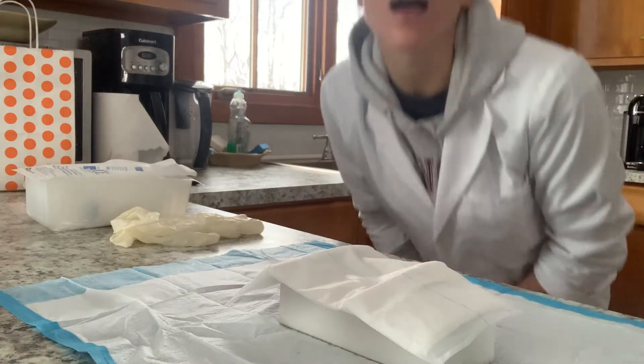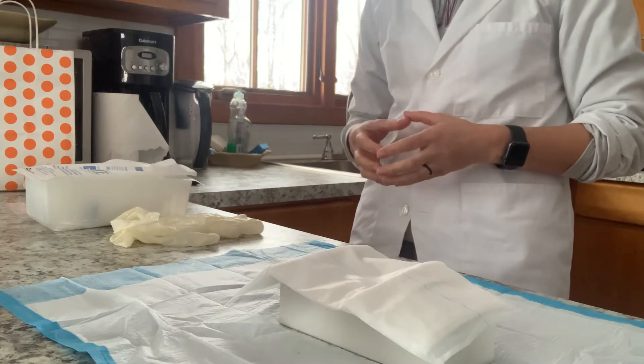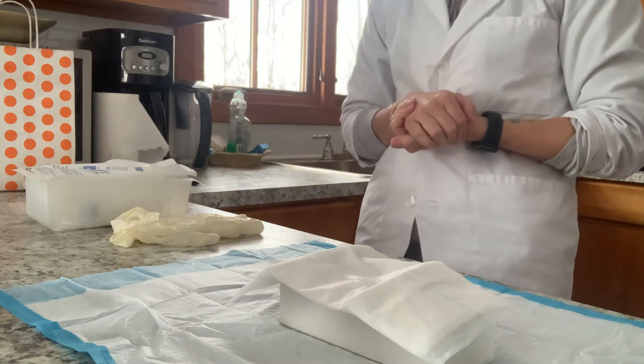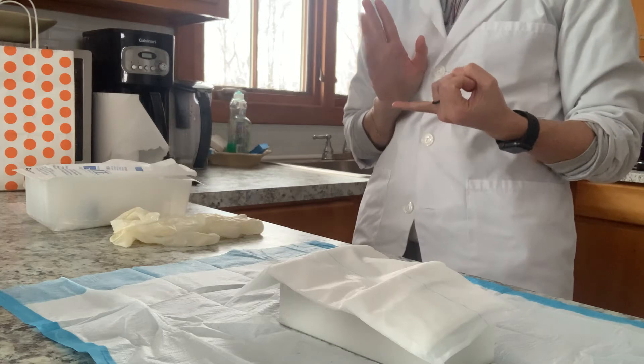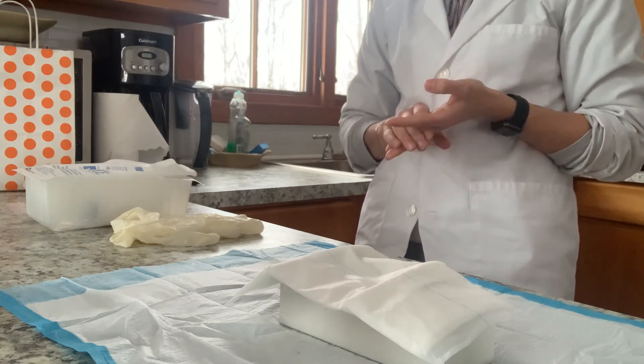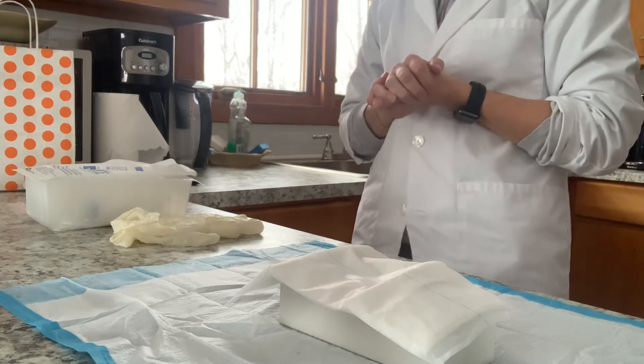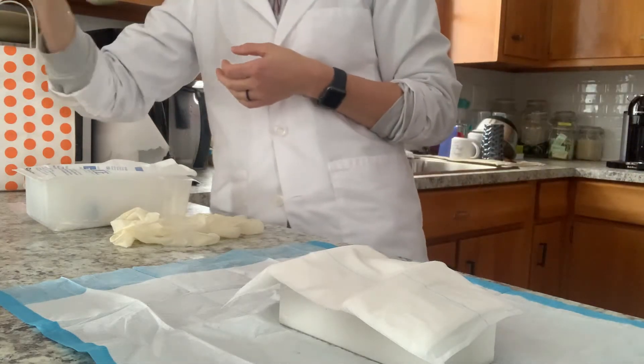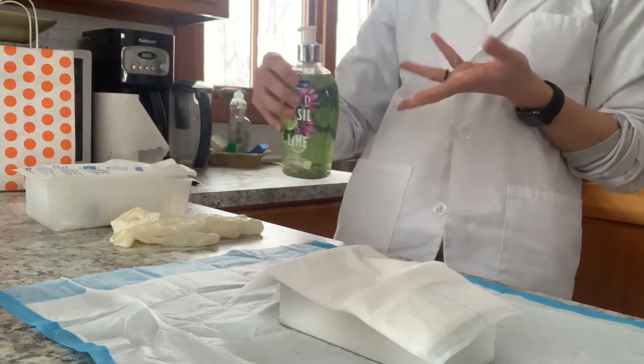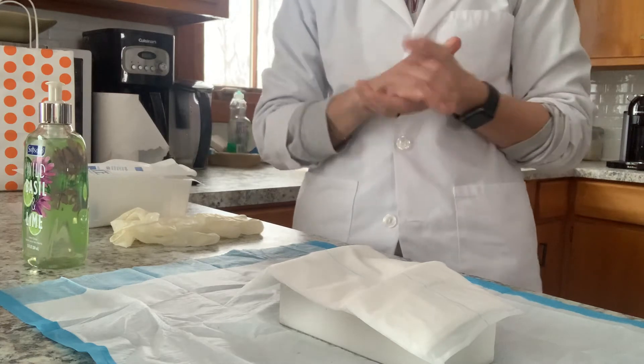Hi, this is Jessica Stern. I am going to be doing my care for a wound. I will be irrigating, culturing, and repacking the wound. So here we go. Wish me luck. I'm going to be using this hand soap and pretend that I will be using it as my hand sanitizer.